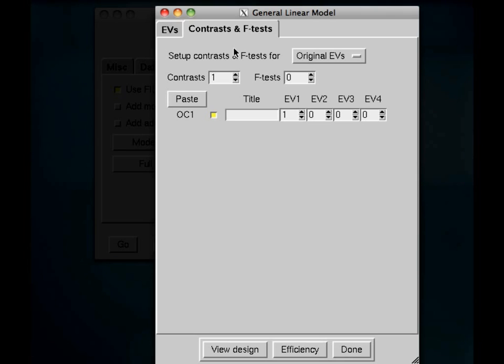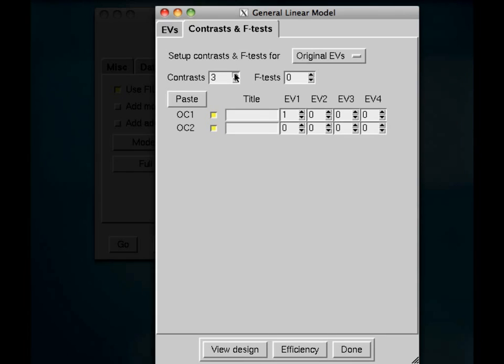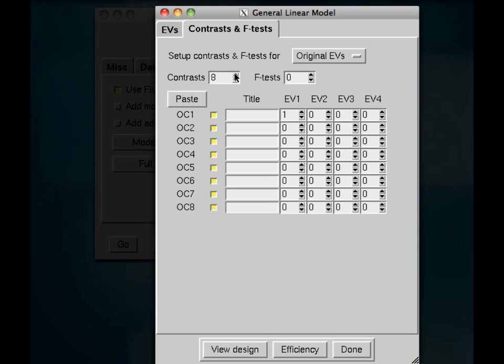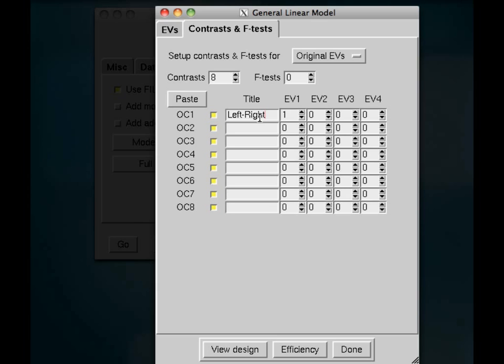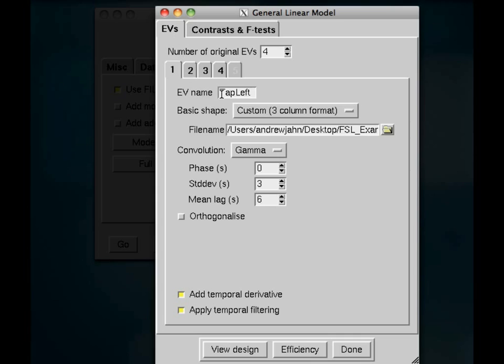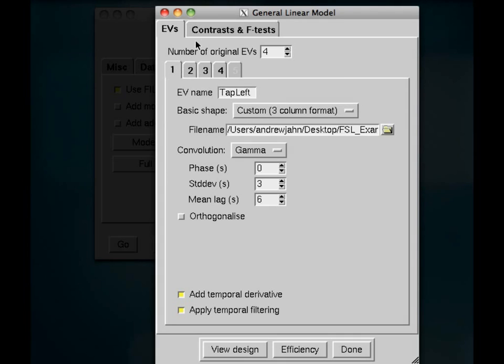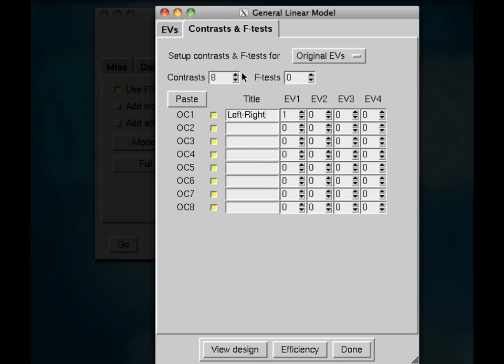This will take the beta weights, which are estimated for each of your conditions, and allow you to either calculate simple effects or contrasts or even F-tests if you want to do that. So here, I am going to calculate a contrast, and I'll show you why in a little second. This first contrast, I am going to say, is going to be left minus right. That's going to be the tap left minus tap right. Now, you should write this down on a sheet of paper just so you don't get too confused, but just make sure you know what each EV is associated with each regressor. So if I go back here, I know that EV1 is tap left, EV2 is tap right, and so on. So if I want a contrast of the tap left minus tap right, then I would want to assign a weight of 1 for tap left and a weight of negative 1 for right.